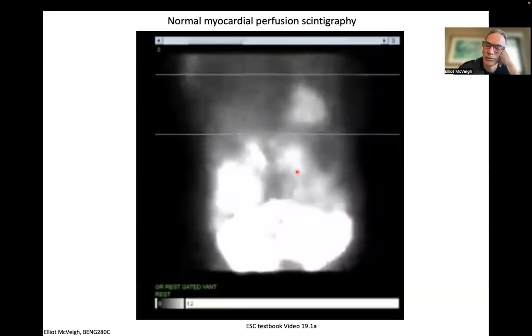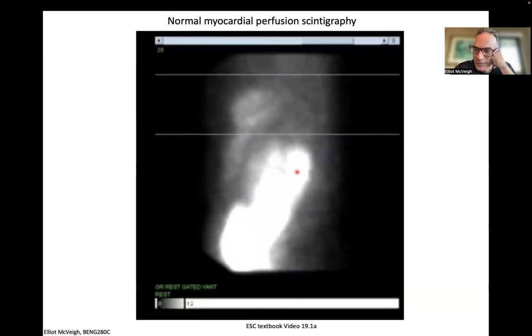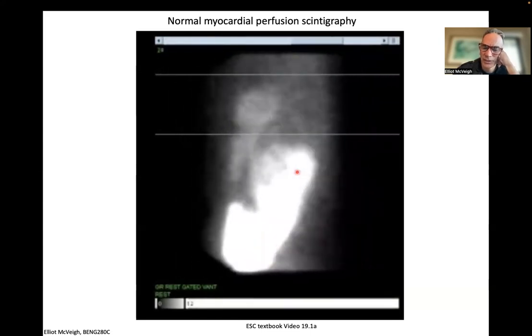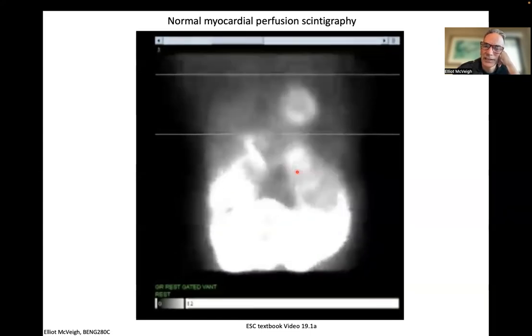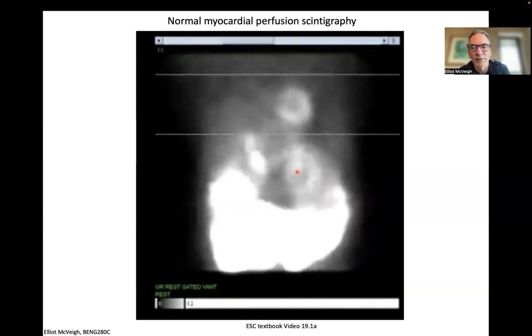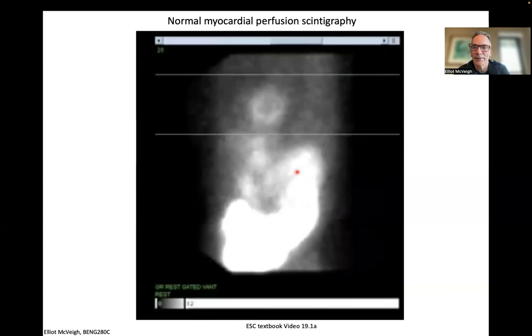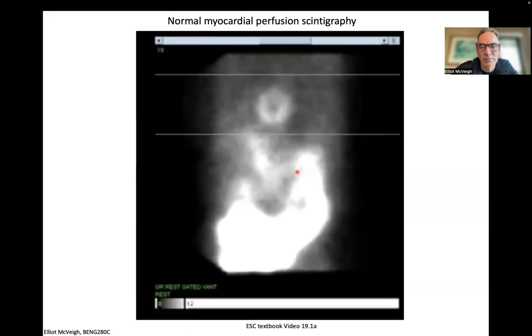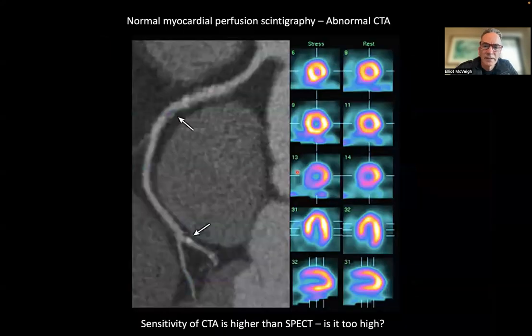Unfortunately, it's not super low dose for the patient, because they have this material injected into their body. They're being irradiated from every organ for however long, about 3 half-lives of that material. And so it turns out that the dose is pretty high. And here's a, excuse me, I'm going to have to stop after this, I'm afraid.